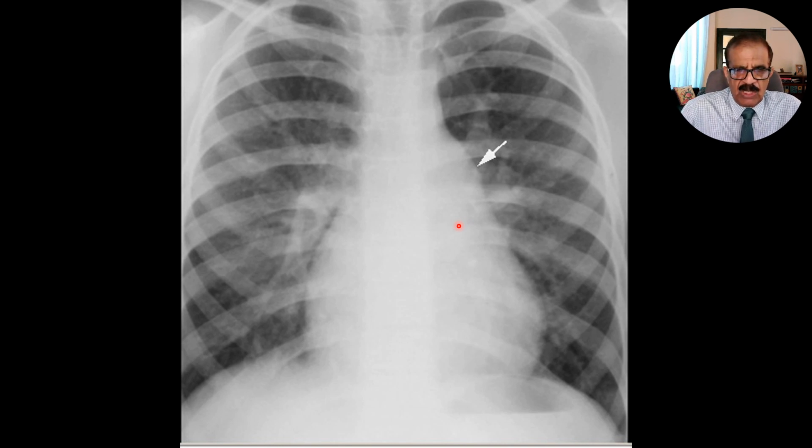many conditions. Number 1, in ventricular septal defect. Number 2, atrial septal defect. Number 3, patent ductus arteriosus. And number 4, primary pulmonary hypertension. Number 5, pulmonary hypertension secondary to some lung disease, and pulmonary hypertension due to pulmonary embolism. So there are actually other causes also. So all these conditions would cause a similar kind of shadow.